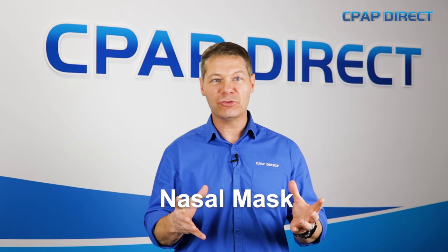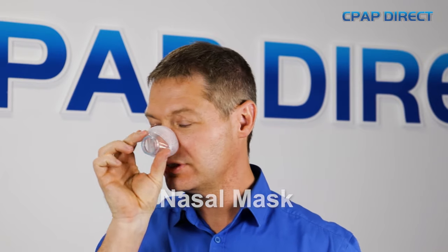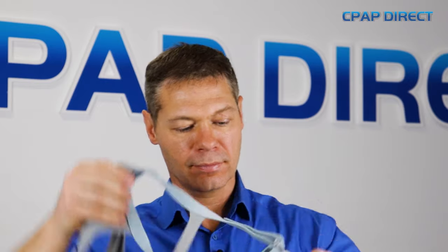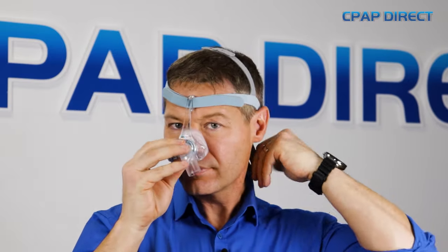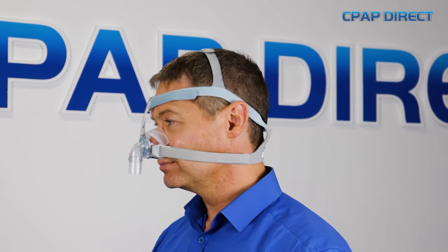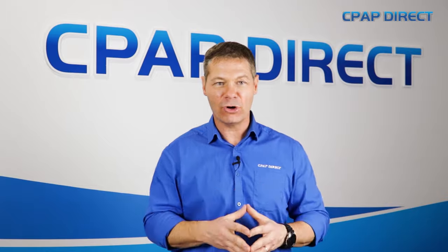The second type of mask is a nasal mask — I like to call it a nasal cup mask. It's a cup that sits over the nose and the air is inside the cup; you can draw from it as you need to. They're super comfortable, nice and quiet, and they don't irritate the nose. Sometimes if you have a moustache or facial hair you can have some issues with seal. However, the majority of nasal cup masks are great — not as minimalistic as pillow masks but a really good option.